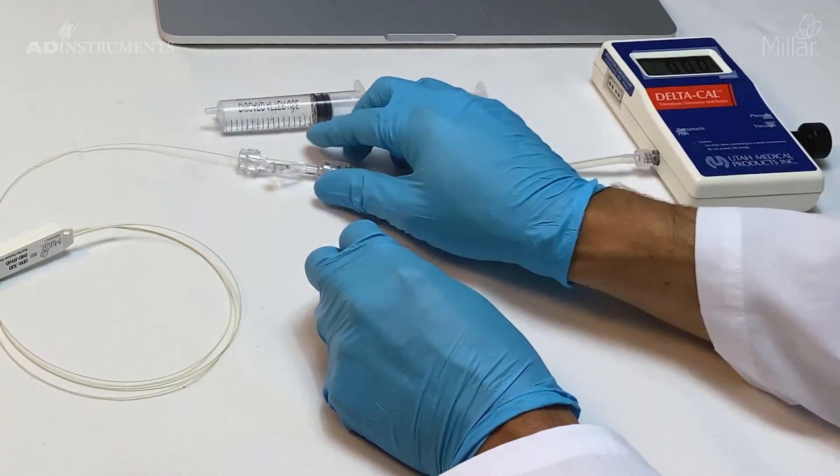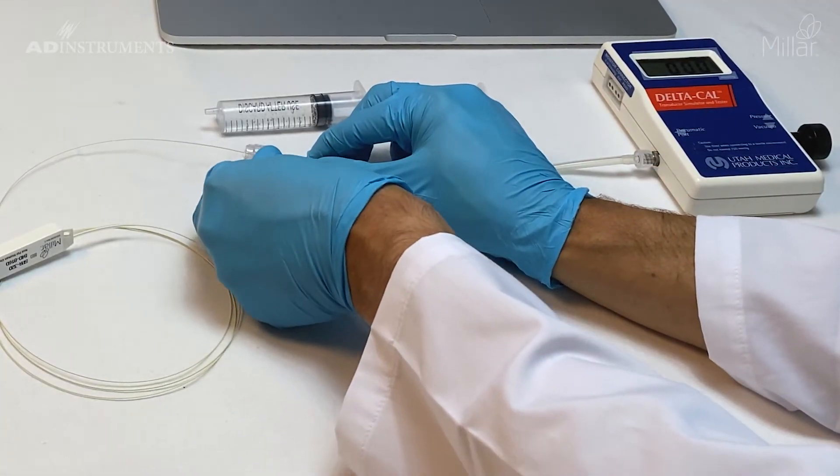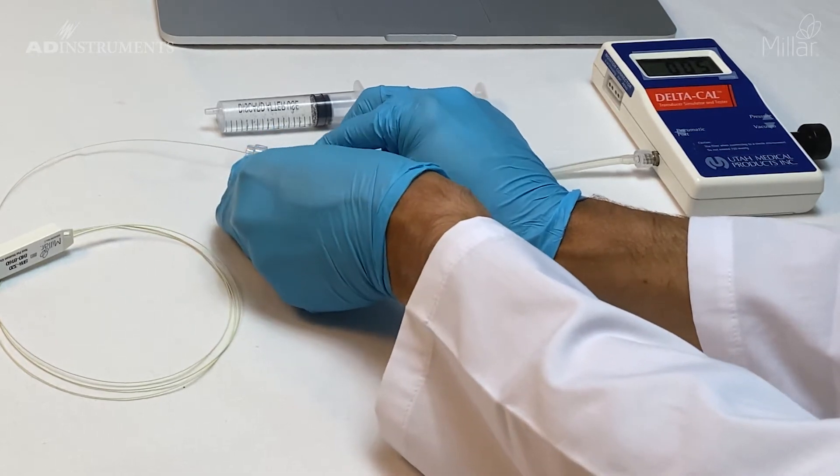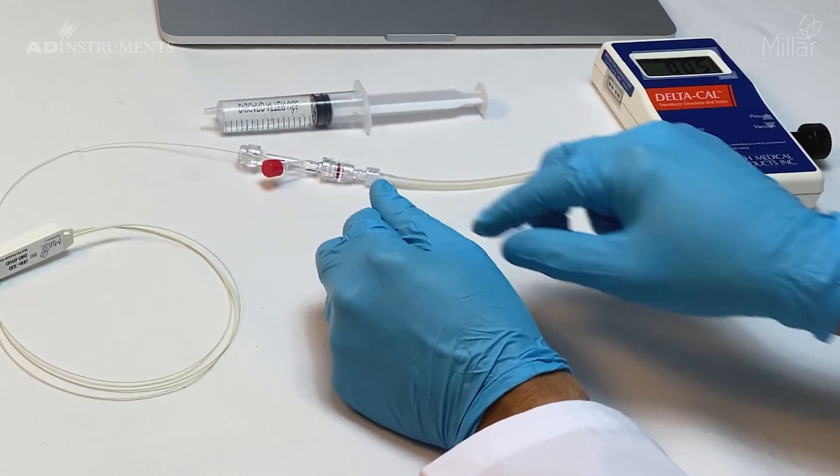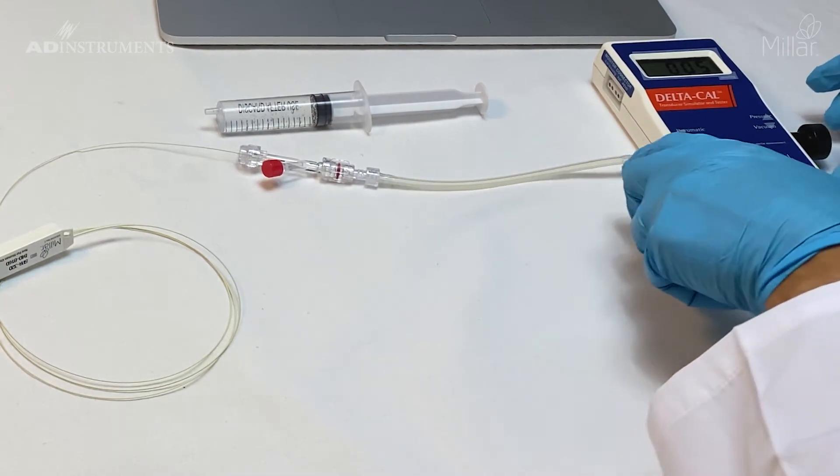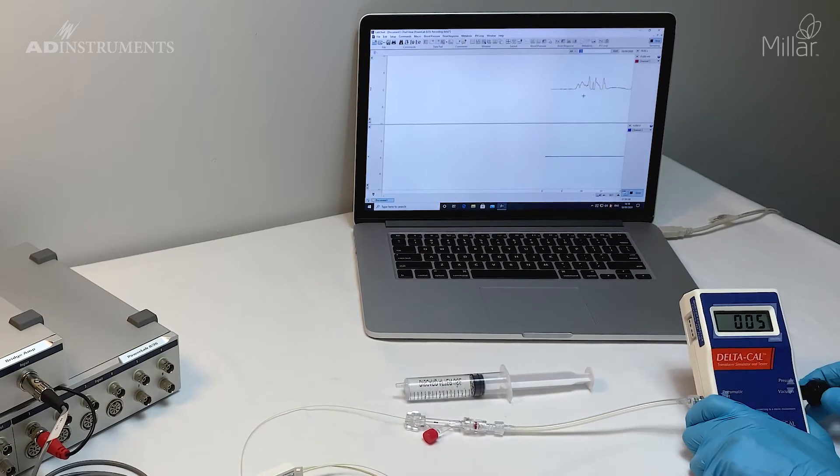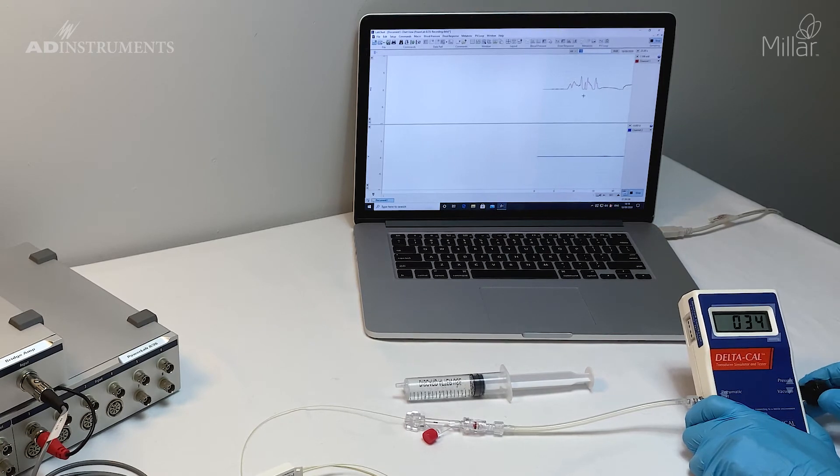Now I'll calibrate for 50 and 150 millimeters of mercury. I'll put the red cap back on to seal the system, then increase the DeltaCal to 50 millimeters of mercury and add a comment for 50.